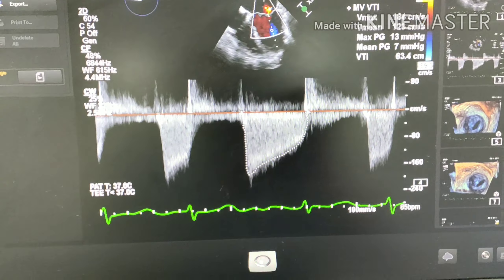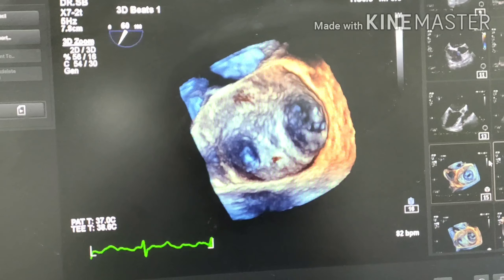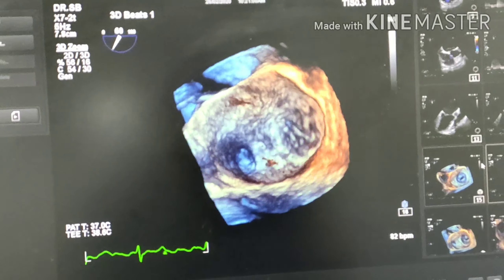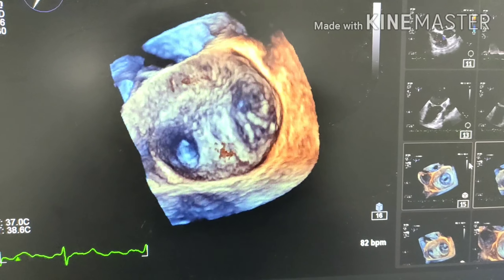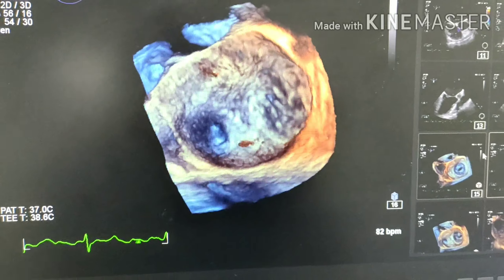We check the left atrial appendage. There is smoke, but there is no clot. Moving forward to look at the left atrial appendage from the en-face view — in this view we cannot see it initially, but if you modify and turn the view, you can clearly see the left atrial appendage opening. There is nothing — no clot. It is a clean left atrial appendage, confirmed on both 2D and 3D.